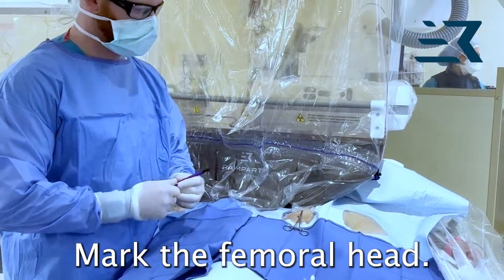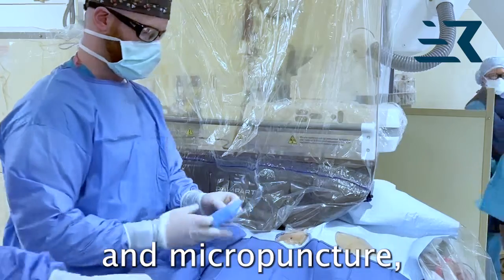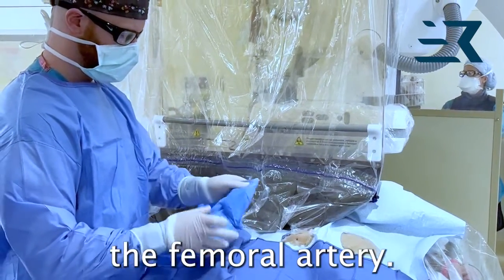Mark the femoral head. Using ultrasound-guided access and micropuncture, access the femoral artery.